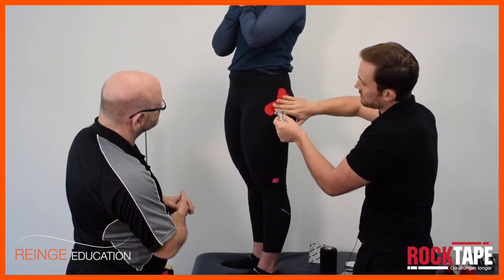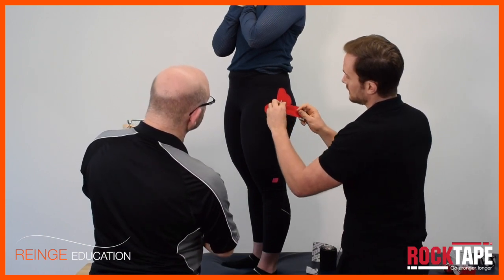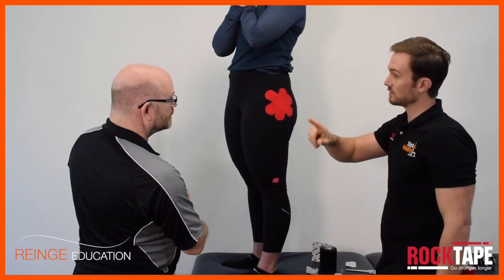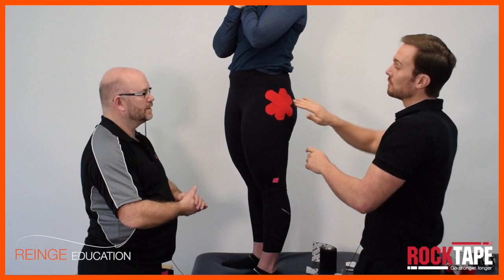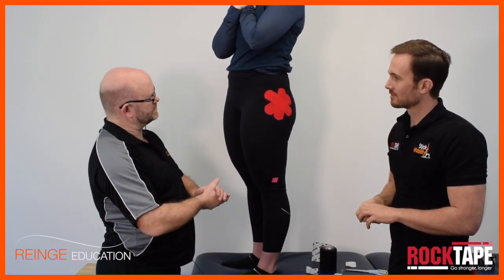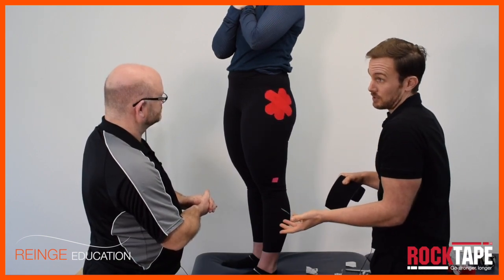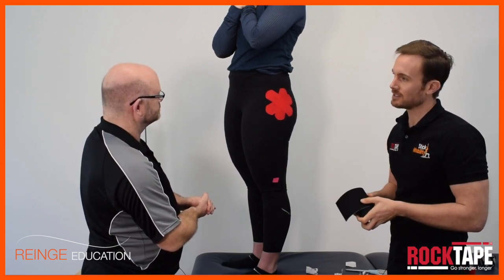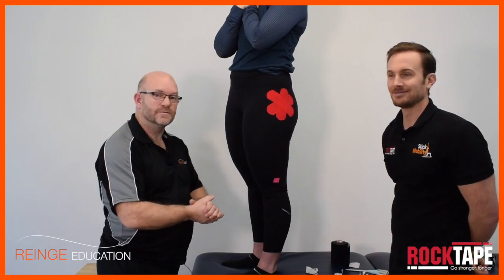I put the second piece over there at an angle, then there's space to apply the next piece of tape, and that creates our decompression star. We've got three pieces of tape with two overlaps — that's really as much as you can do with decompressions because you've run out of space. If you start putting more tape on it just gets clumpy and doesn't work very well clinically. The decompression star can be a lovely way of reducing pain from sore areas. And why a star — can't you just take a big flat piece of tape? You can, and that achieves much the same thing. It might come down to your preference or what tape you have available.